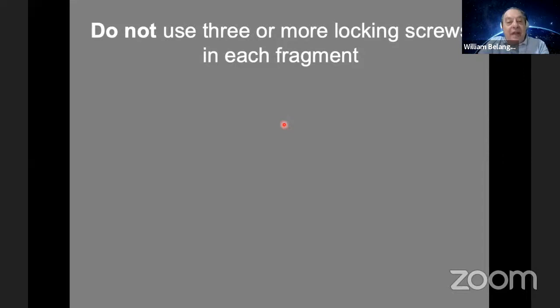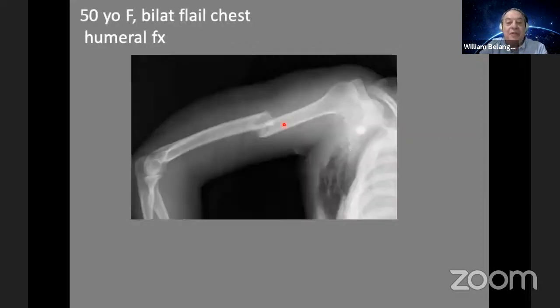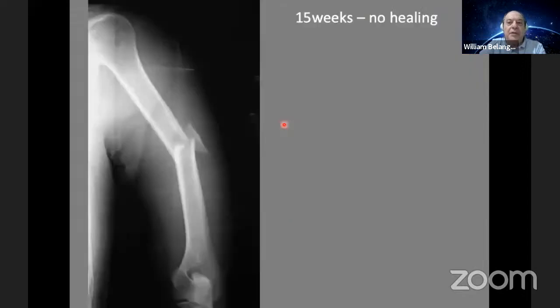Another tip: do not use 3 or more locking screws in each fragment because it increases the stiffness and reduces the callus formation. This is a very nice example. This is a transverse fracture. You see, in this fracture, we use 2 locking screws in each fragment, and cortical screws in the center of these 2 locking screws. You see, very good callus consolidation.